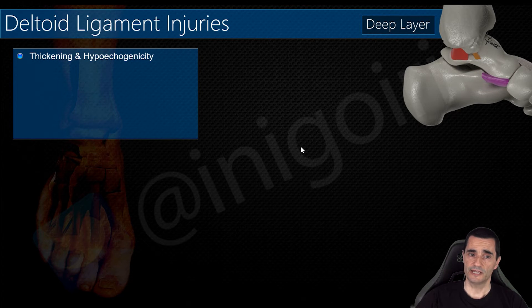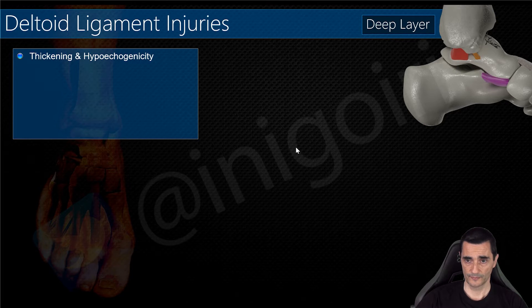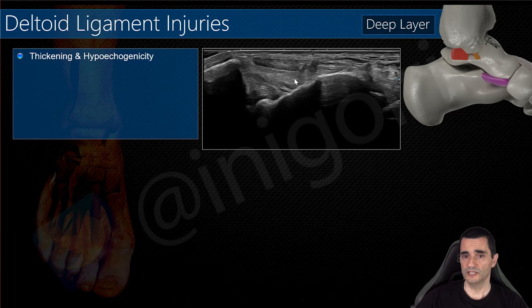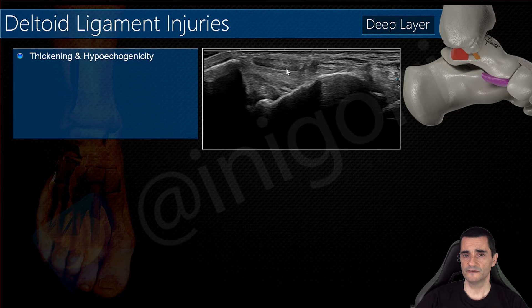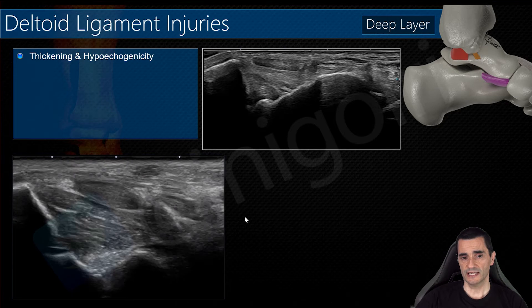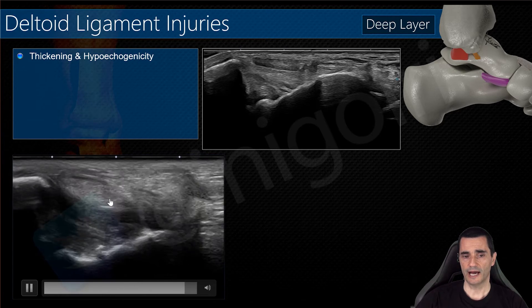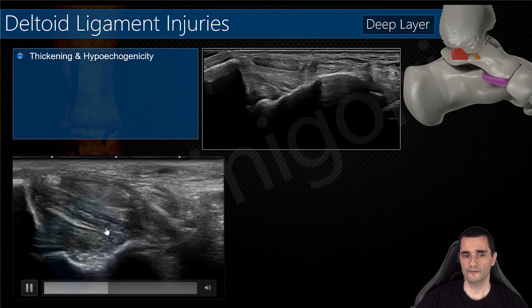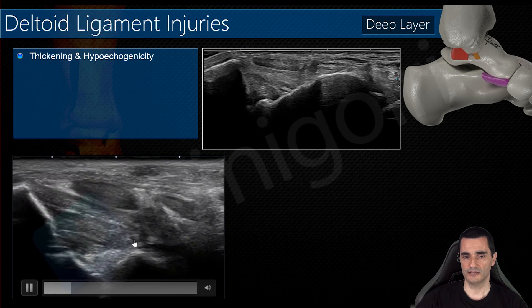When we have a ligamentary injury, we will find thickening and hypoechogenicity of the ligament. Looking at a normal ligament, you can see this fibrillar pattern in the posterior tibiotelar ligament and its echogenicity is very similar to the surrounding structures. Always perform dorsiflexion of the ankle to obtain this image. In this case, you can notice the thickening and hypoechogenicity of the ligament — this is the posterior tibiotelar ligament.